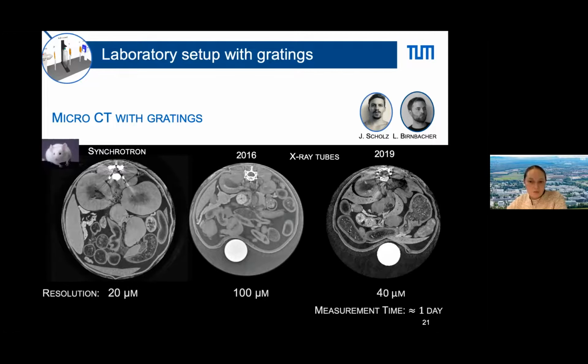But if you're more interested in material science and samples which should not be measured in a fluid environment, then I would build something less sensitive, and for that more flexible at higher energies. But now what we do is really measure the spectrum, put it into the simulation, and simulate the whole process.